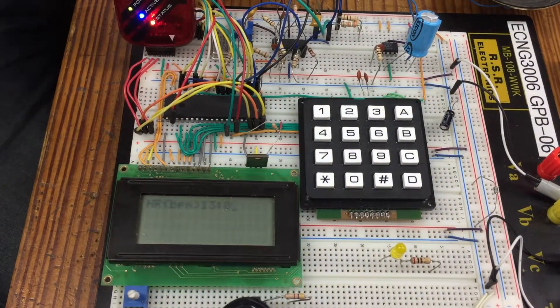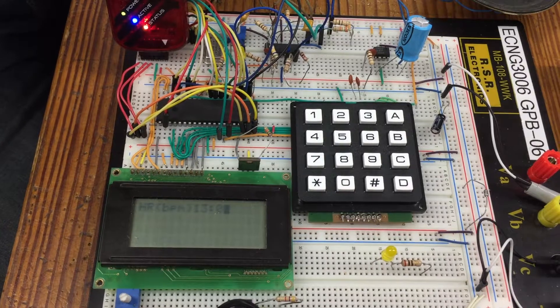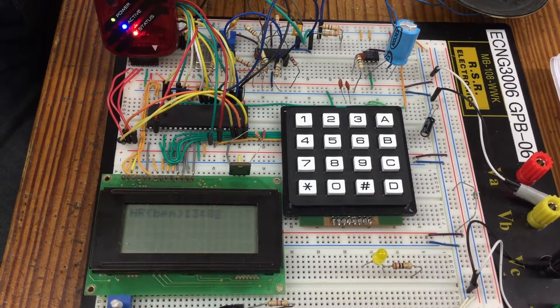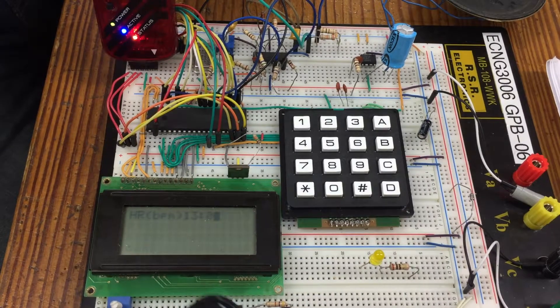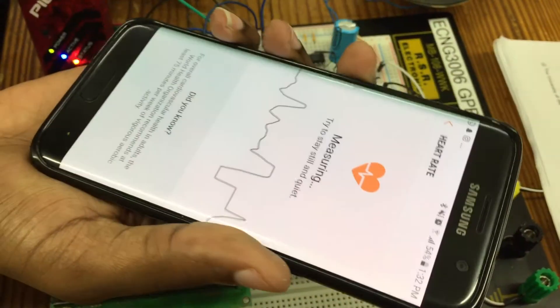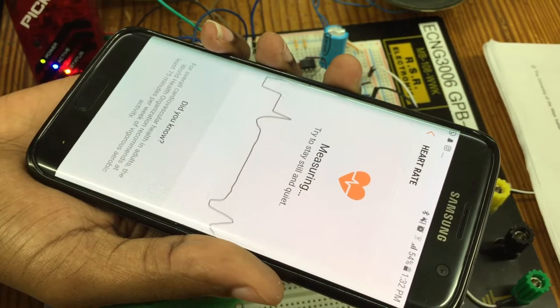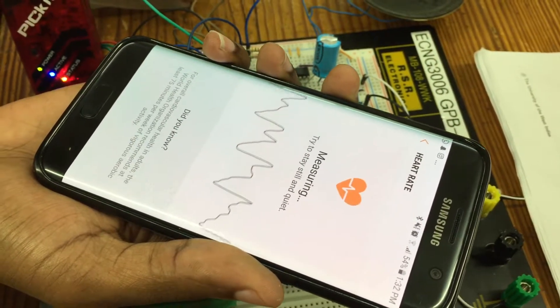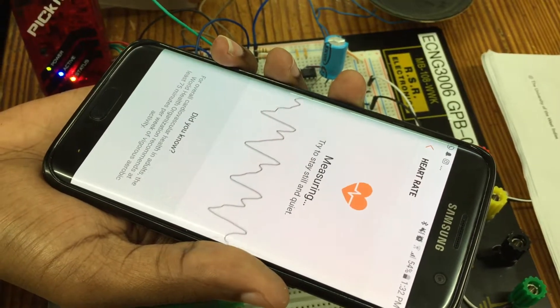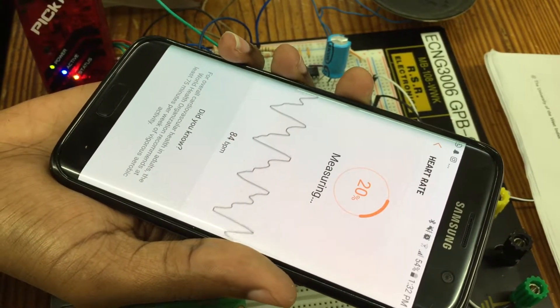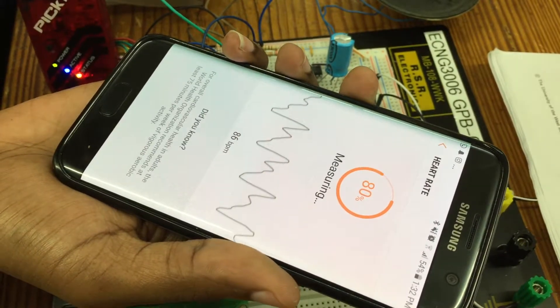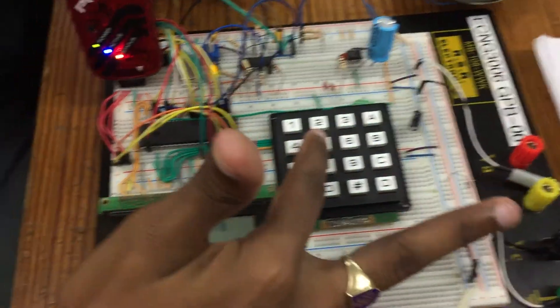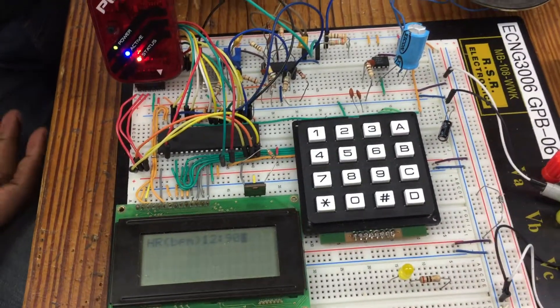So one is on my phone, the heart rate sensor on my phone. So you can see like 87 beats per minute. And we have approximately 90, so it is relatively accurate.